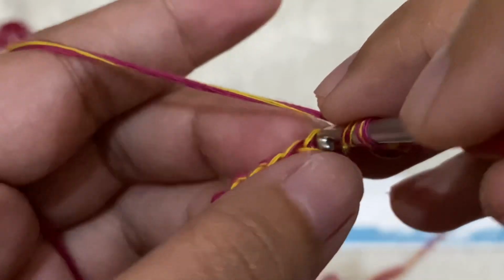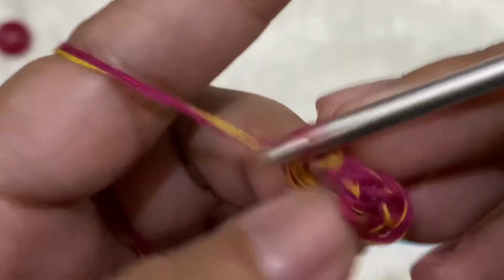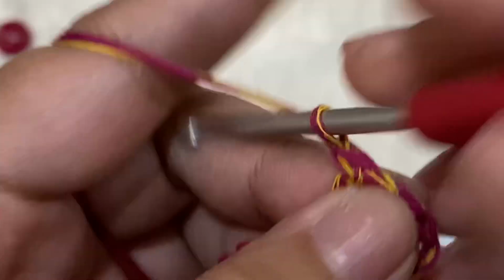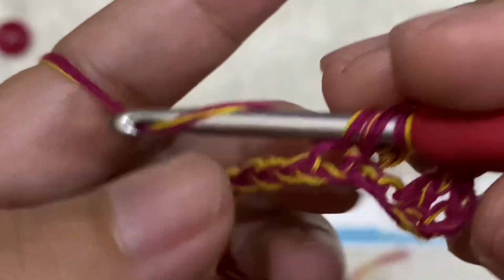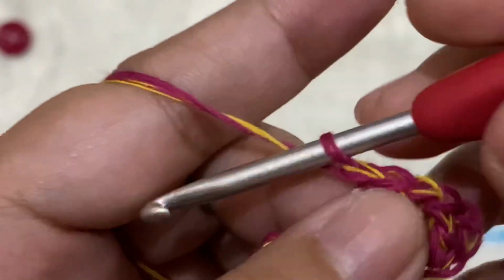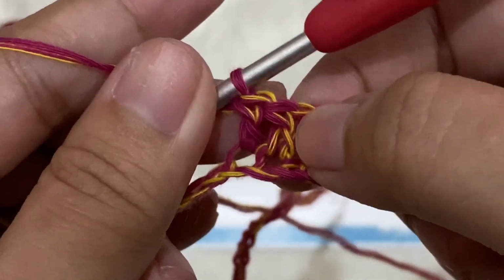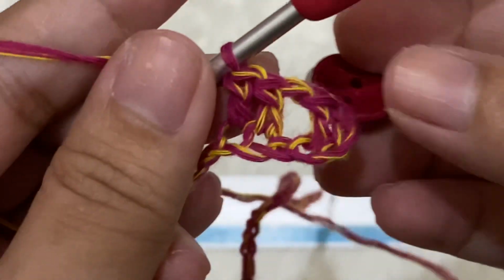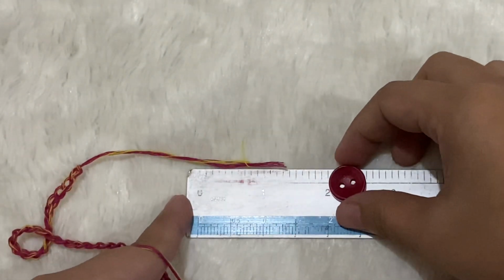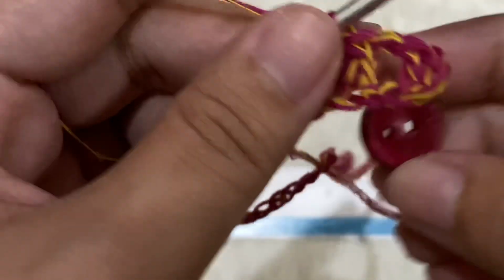Okay, so we will now have a chain space right there. Okay, and then another double crochet on the next chain. So there we already have that hole for our button. So that's our first buttonhole. Okay, so my button is a bit small. Okay, right there it's about half an inch, and it fits perfectly into that space.